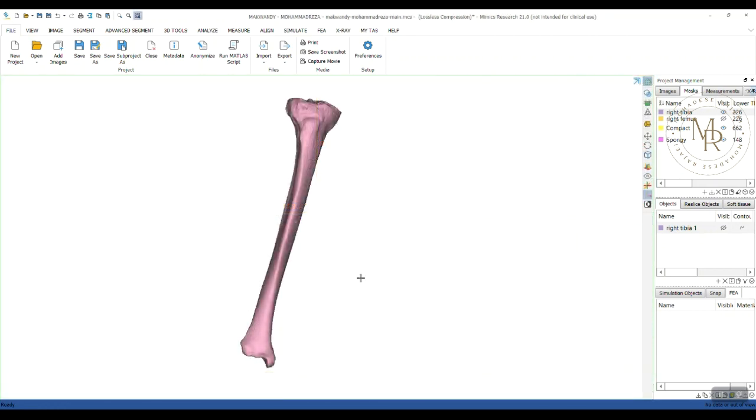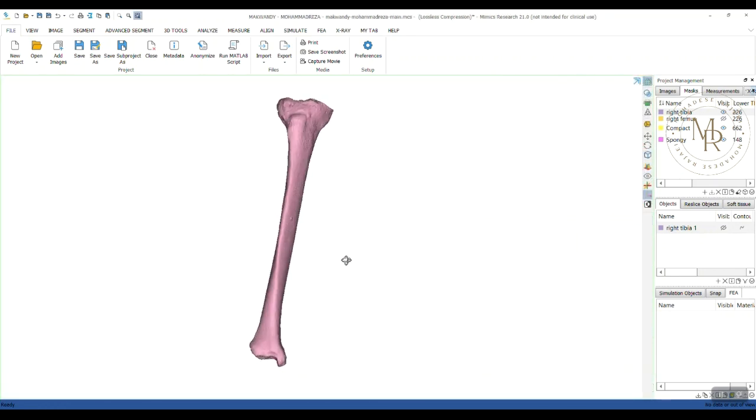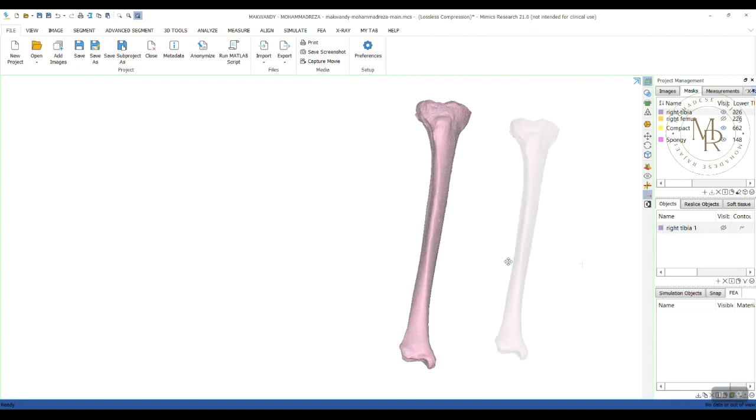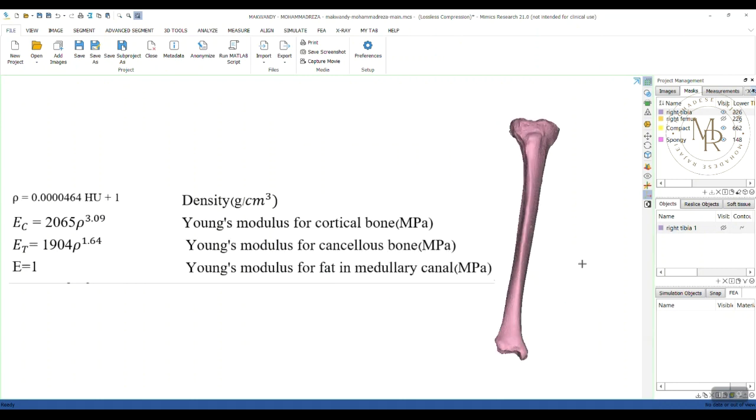I have a tibia bone here as you can see. Also, I've got the equations of its density and Young's modulus based on HU values.